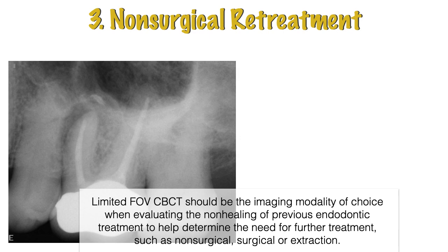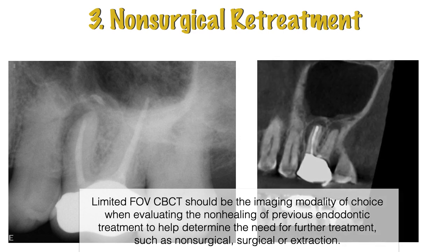Any CBCT is not needed because the reason why the treatment is failing is very clear. But if it's not, then a CBCT is warranted. So if you look at this upper molar there, see that there is a mesiobuccal root, and then the palatal and the distal buccal root seem to be overlapping. There is a large lesion around the apex of the mesiobuccal root. So not 100% sure what's happening there.